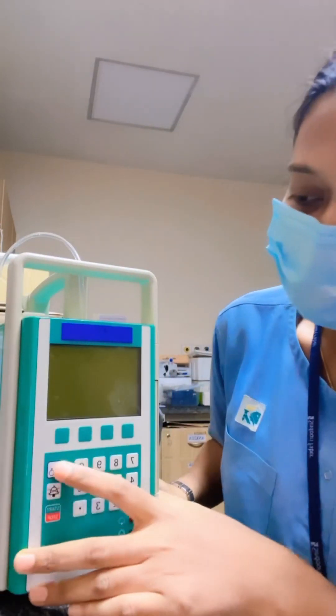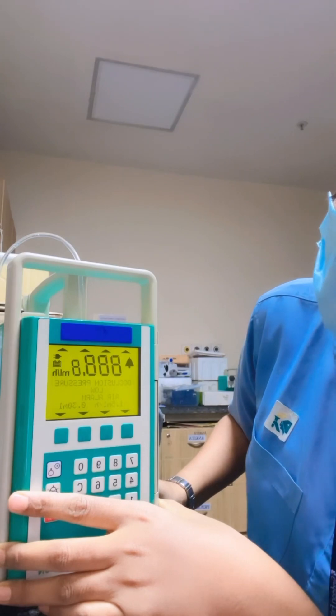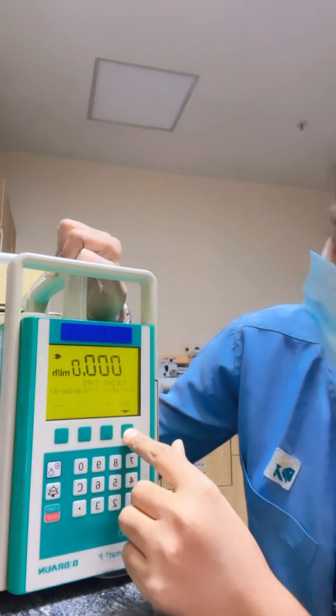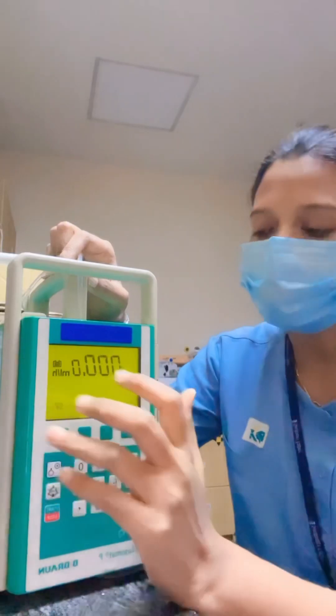For switching on, press this button. As we are already using Intrafix, it will automatically detect Intrafix P, so press yes. There are three parameters that can be set: rate, volume, and time. If you fix any two parameters, the third will automatically be calculated.